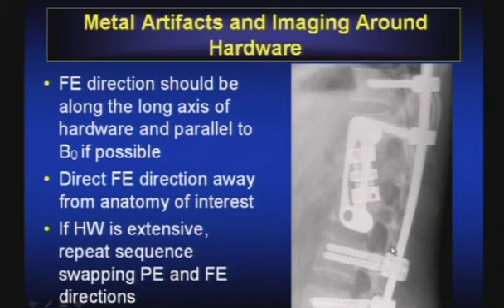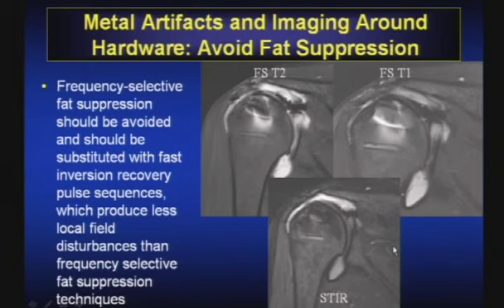It's a good utilization of your time, not a bad one. Another common sense thing, we avoid chemical fat suppression. And by the way, these common sense things for you are not common sense things to your technologists. Okay? So if you say, do the classic things we would do for imaging around metal, that's going to be totally foreign to them unless they're used to doing it.